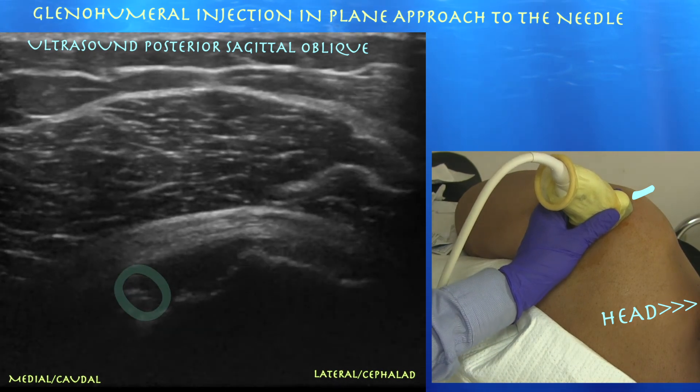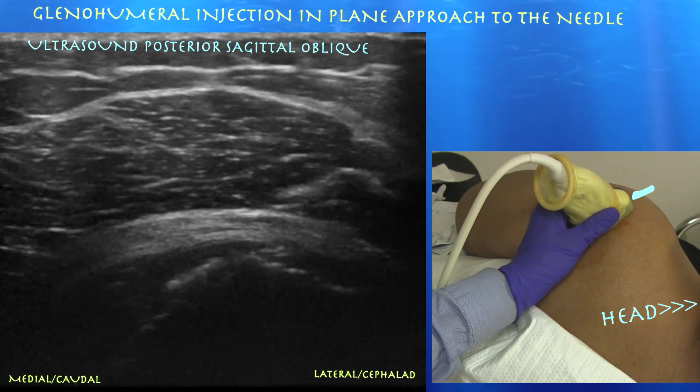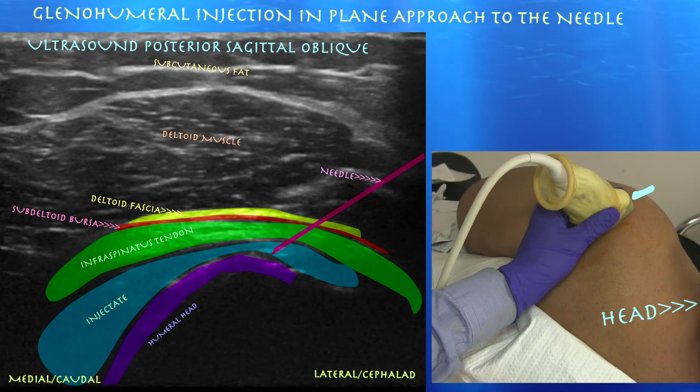Here's a little flash of the injectate. You can see it surrounding the underbelly of the infraspinatus tendon and also surrounding the humeral head.